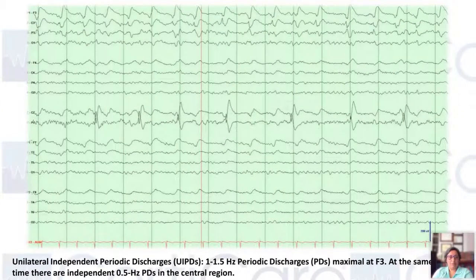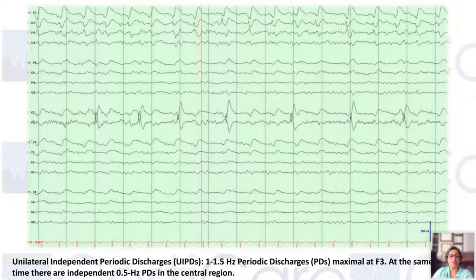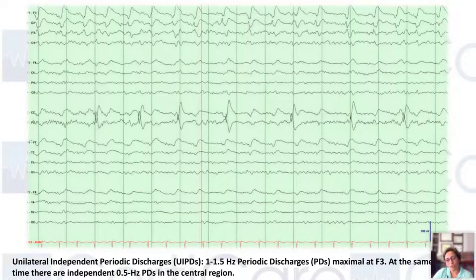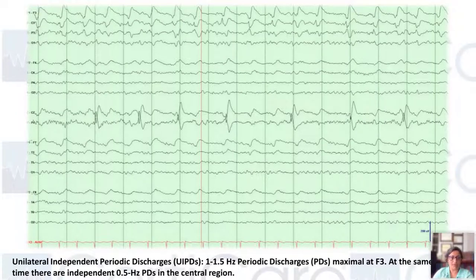This category of LPDs is called unilateral independent periodic discharges. Looking at this image, you can see discharges on the left side at 1 to 1.5 hertz, and there are independent discharges at the midline. They are still considered unilateral. If you are seeing discharges on one hemisphere and in the central region, the central one is to be considered on the side of the LPDs — not generalized, but unilateral and independent.